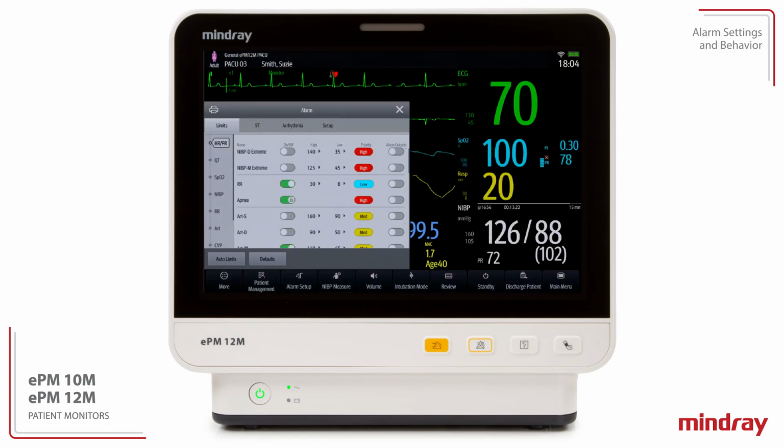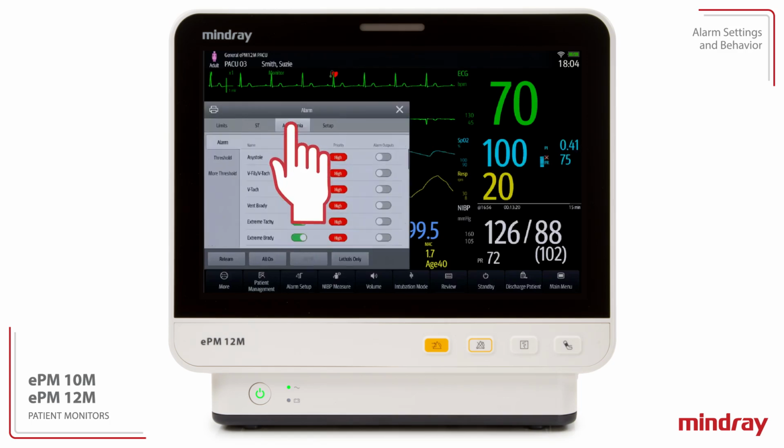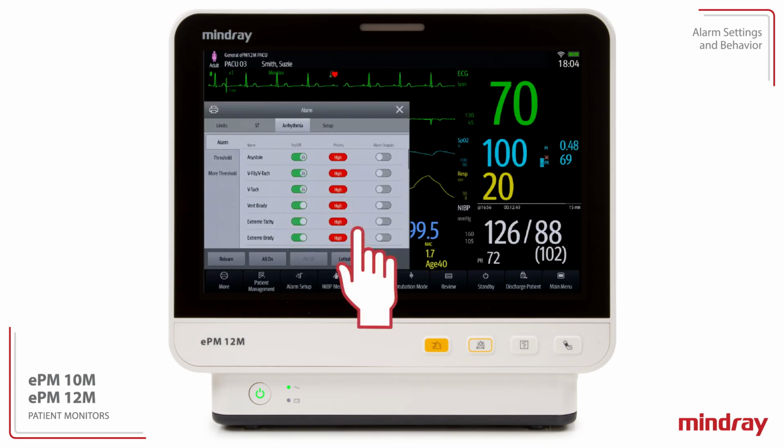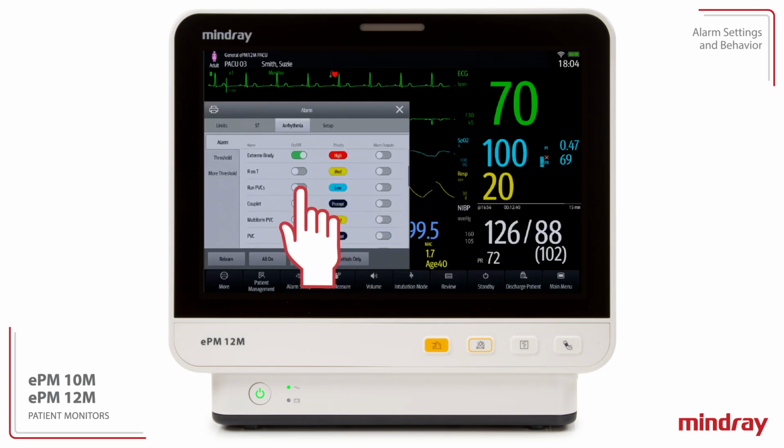Within the Alarm dialog, the Arrhythmia tab provides access to all arrhythmia alarms. Functions include an on-off switch, priority, and alarm outputs. In the On-Off column, a green switch indicates the alarm is on and active. The lethal alarms of asystole, VFib, and VTAC are locked on with a priority level of high. Extreme tachycardia, extreme bradycardia, and ventricular bradycardia are high when active. For other arrhythmia alarms, select the switch in the On-Off column to enable or disable.